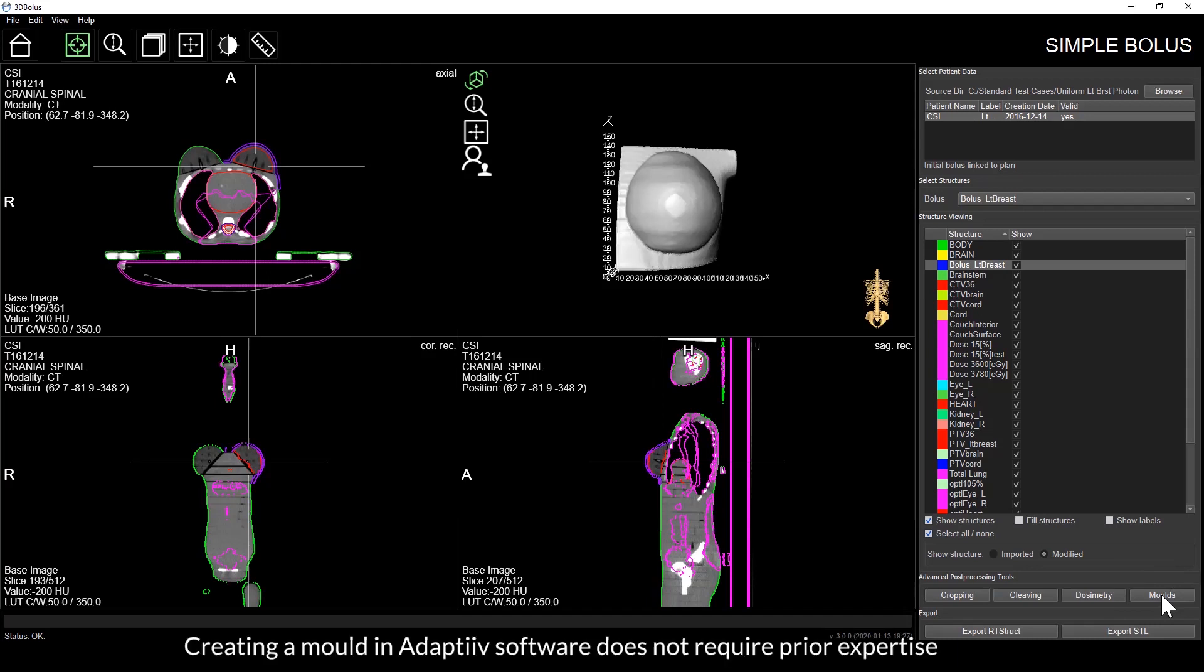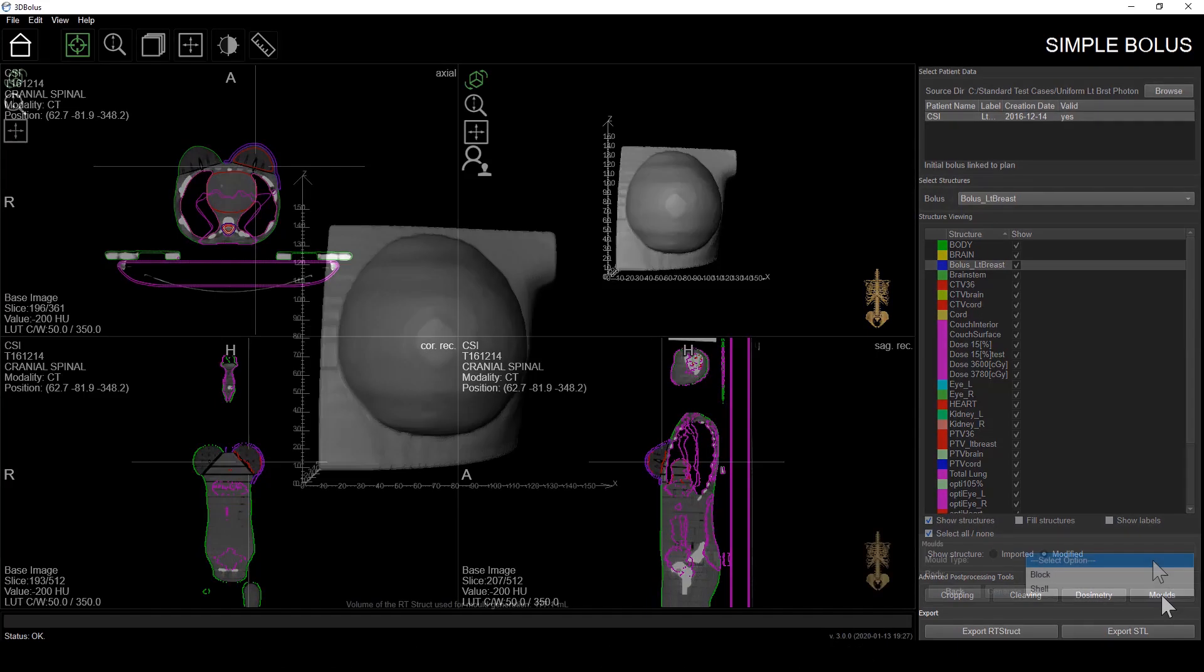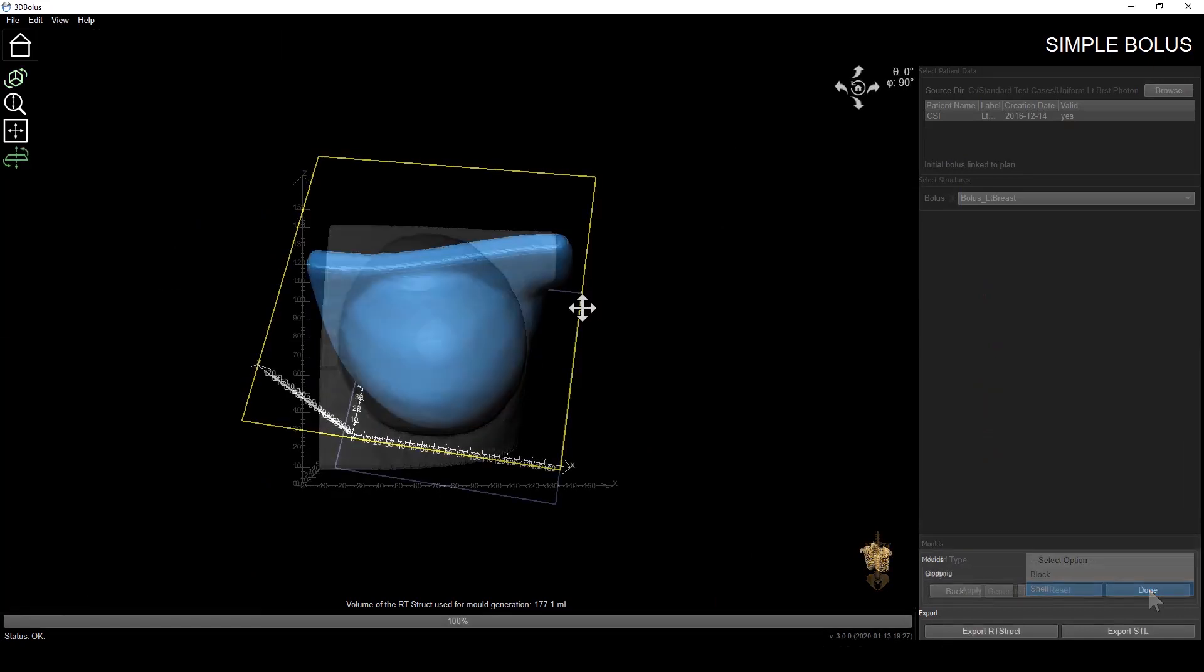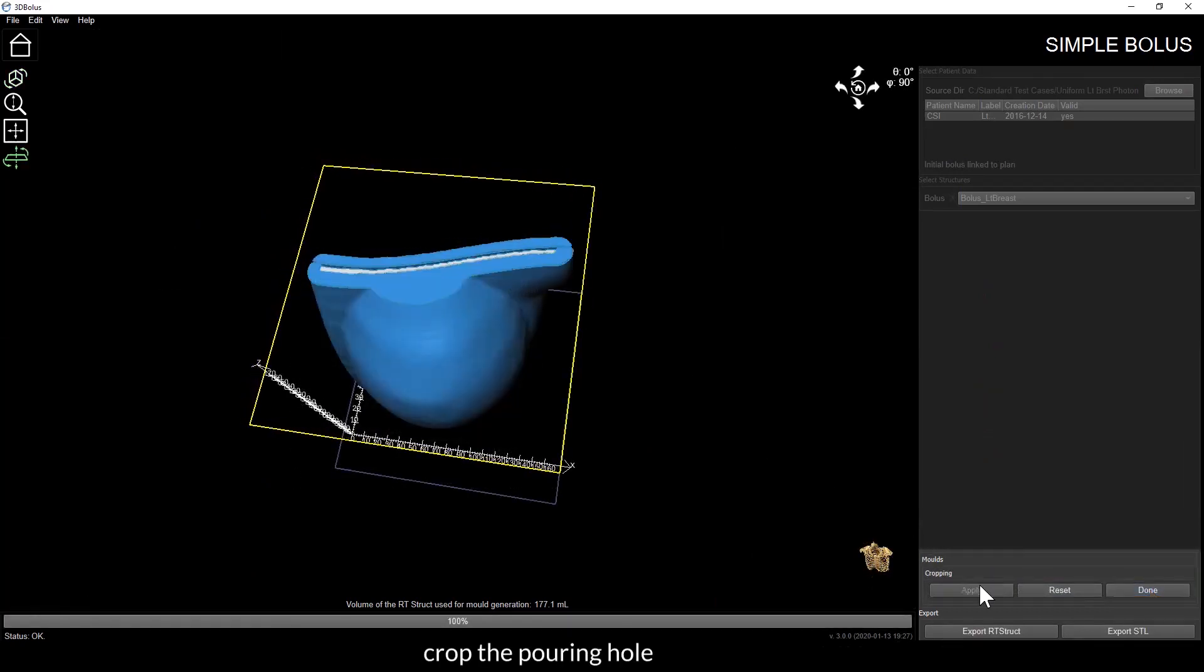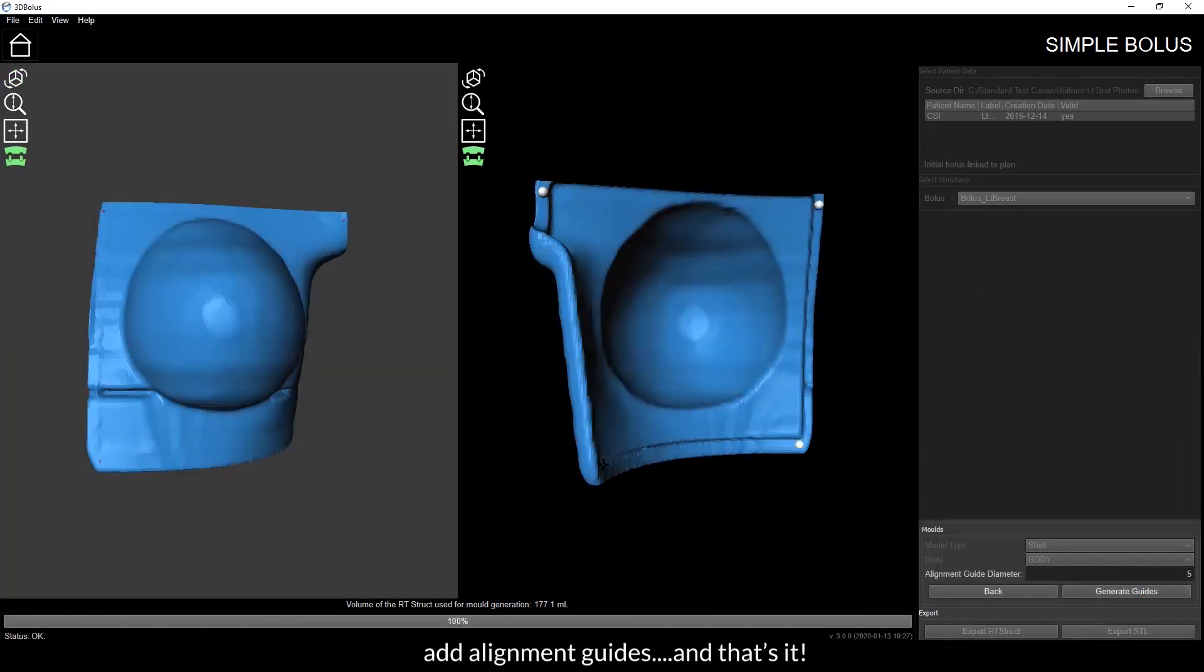Creating a mold in Adaptive software does not require prior expertise in CAD software nor advanced knowledge in 3D printing. Once a bolus is generated, all you need to do is select the mold type, crop the pouring hole, add alignment guides, and that's it.